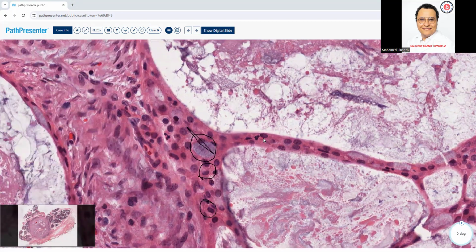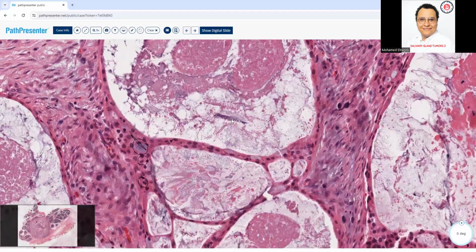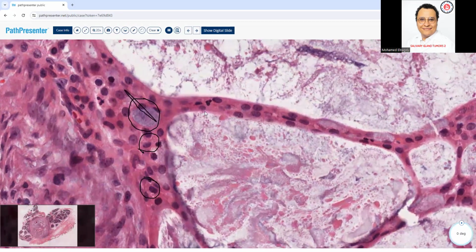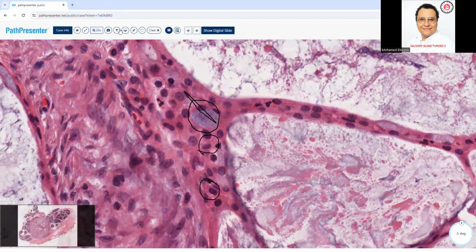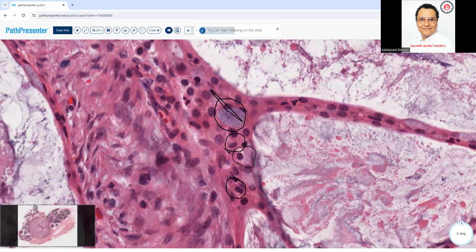And then you have big, huge lakes of secretions, which are highly likely mucus, I think. I think these are lakes of mucus, because they're related to these mucus cells. See, the cell is repeating itself. Here's another mucus cell. So I would believe that these are kind of pools of mucin, maybe.